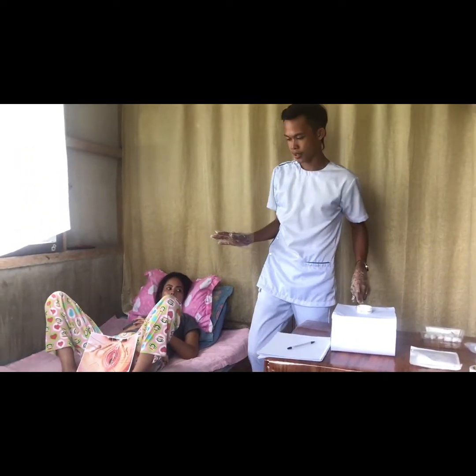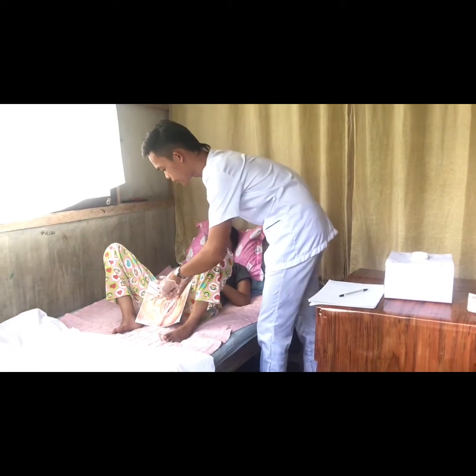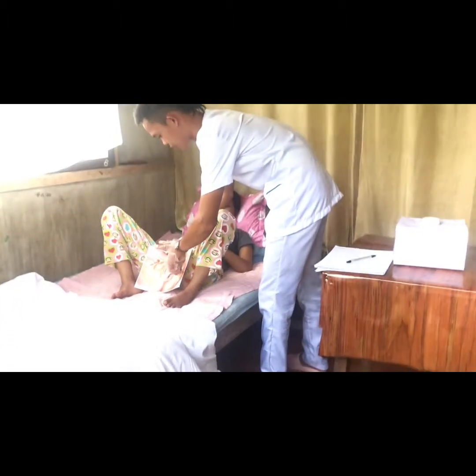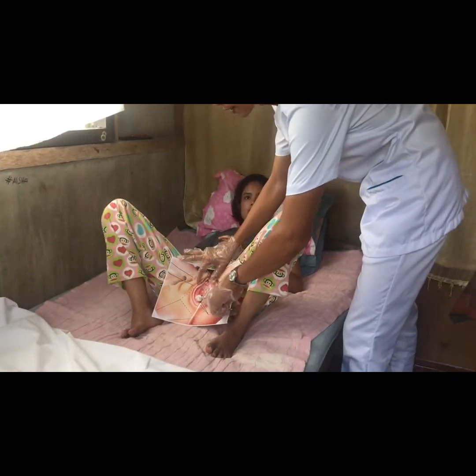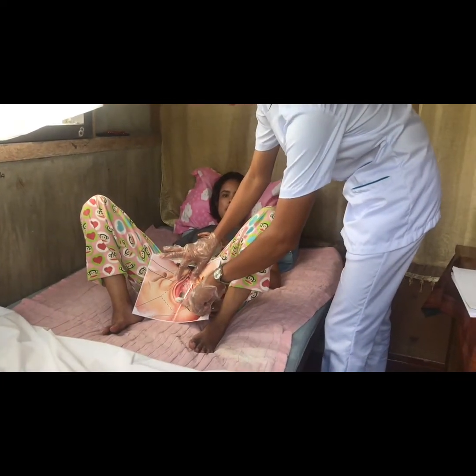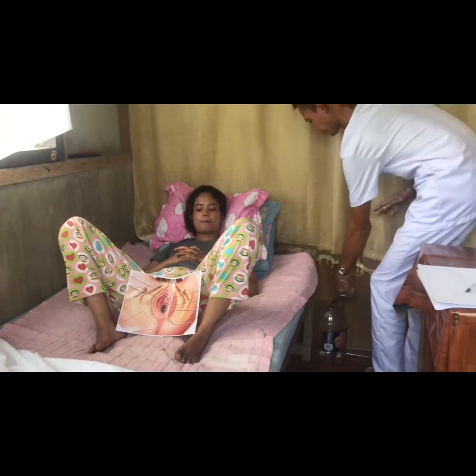And then after that, for the third cotton ball, this is the last ball. I'm going to soak it with disinfectant solution, and then after that, for this time, I'm going to clean the middle portion of the private part of the patient. How are you, ma'am? I'm okay. Okay, thank you.